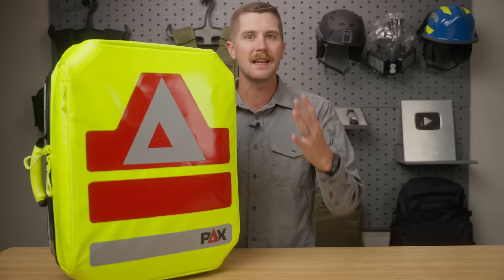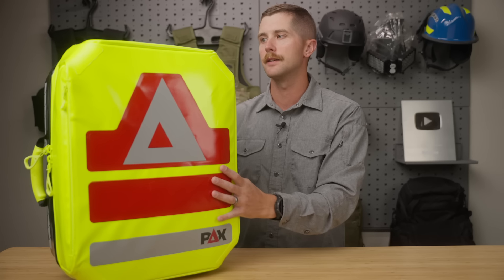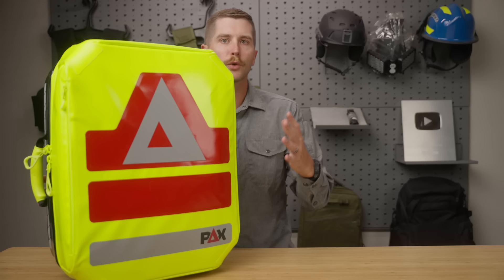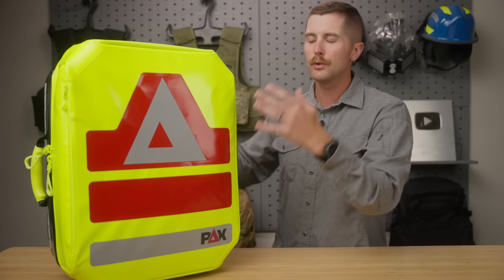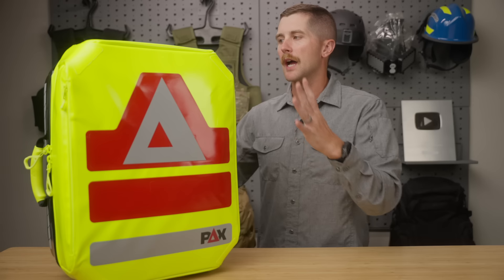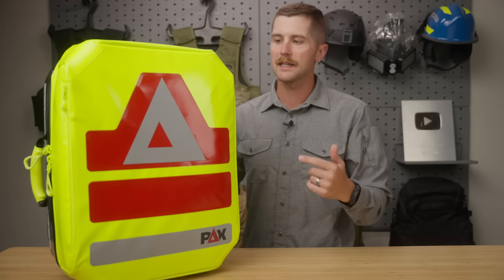Make no mistake, this is an EMS backpack. It is not intended for the everyday person. Keep that in mind as we go through the video. I'm reviewing this pack and also the modules that go into it. This is a very, very customizable pack. While the pack itself is the focus of the review, we're also going to be going through some of the components you can get with it and how it can be customized. I don't want to drag this out, so let's get into it.